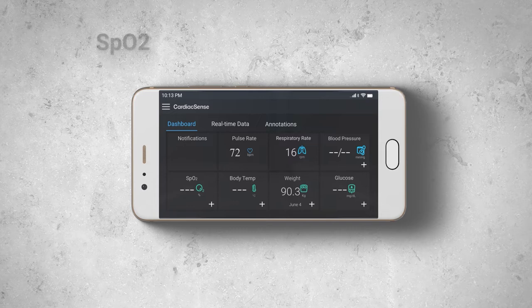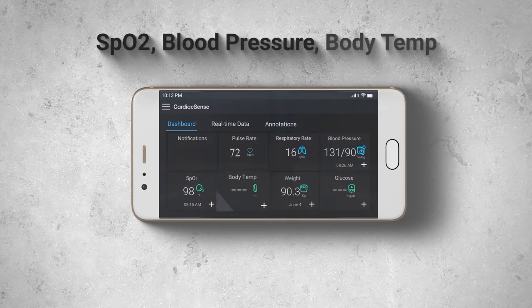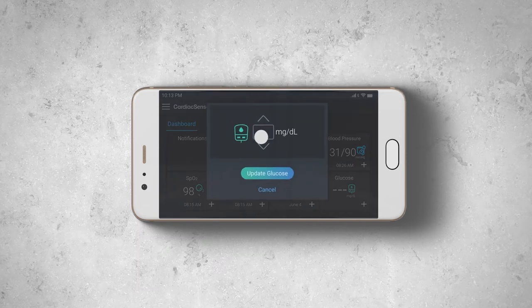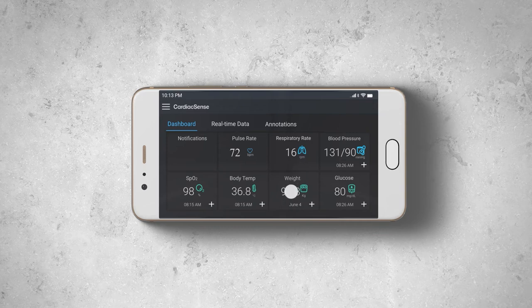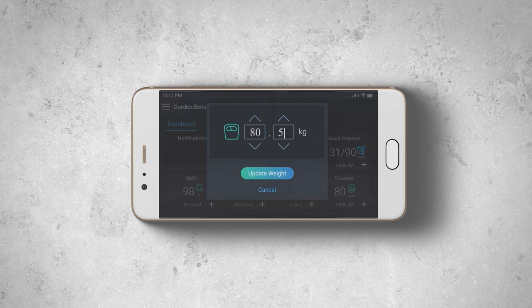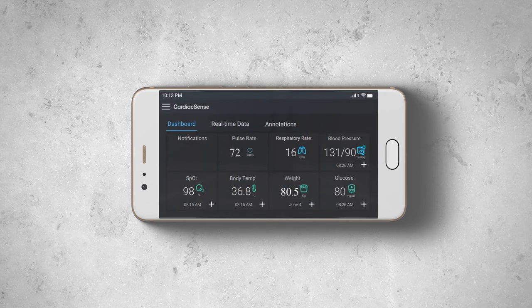The dashboard will also show your most recent measurement of SpO2, blood pressure, and body temperature. Glucose and weight values need to be entered manually. The dashboard displays a red alert if any of your vital signs cross the set thresholds.